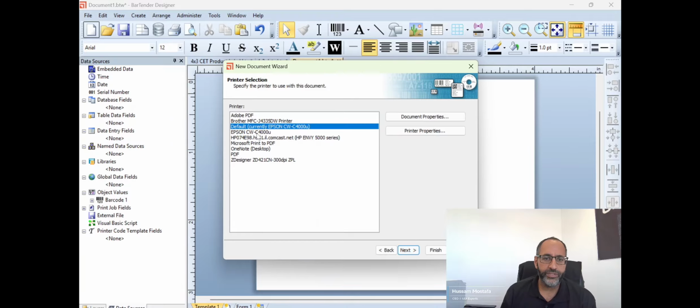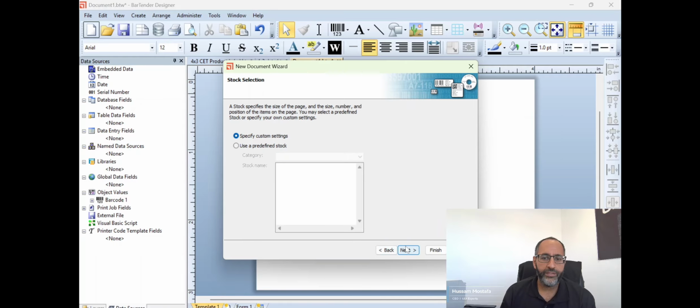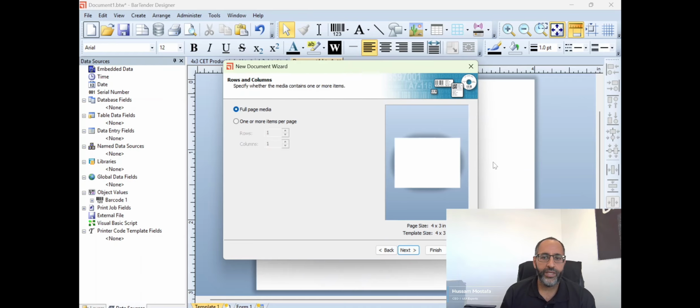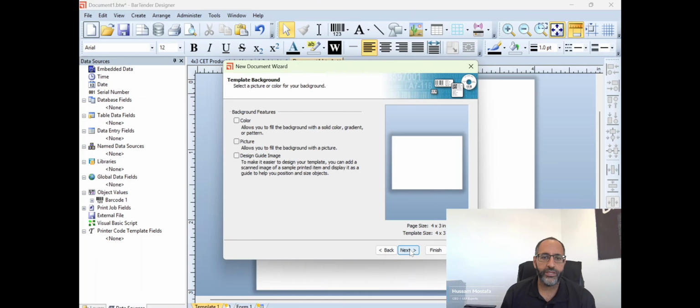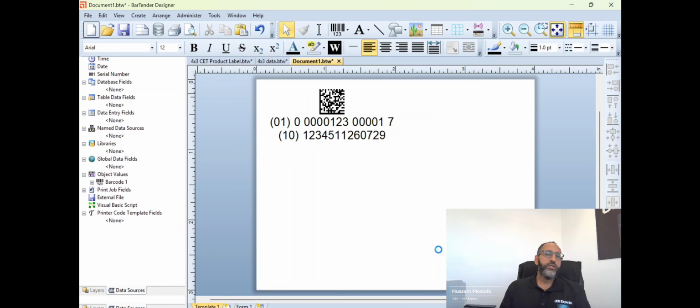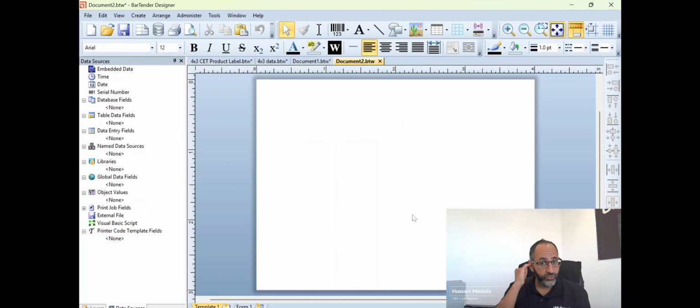We're going to use, in this case, the Epson color printer. So we'll click Next there. And the settings, we'll keep as is. It's going to be a 4" by 3" label. So click Next. And it's going to show on this full page, the 4" by 3". Next. And we're not going to have any background features. And we'll click Finish. So this is going to bring a new template up.